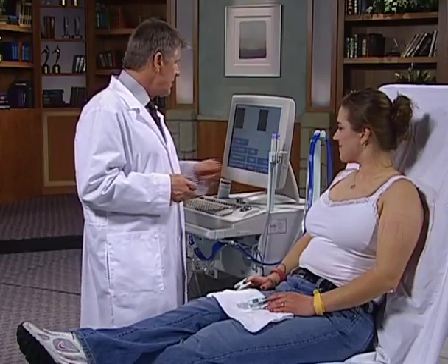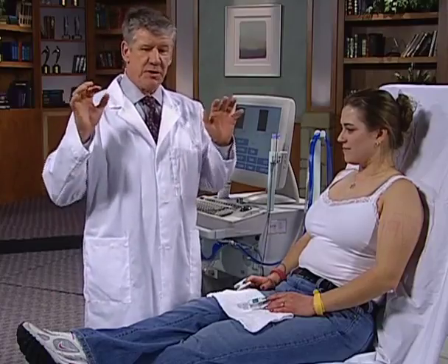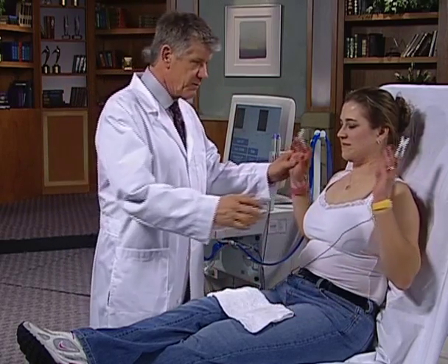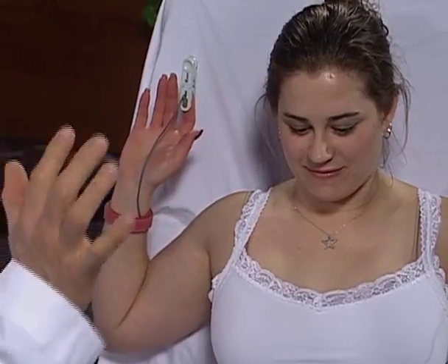We'll move on to our next site, which is going to be the costoclavicular move. This is with elbows back and hands up, palms out, sometimes called the stick-up position. So let's go ahead with that, Danielle. Sort of arms up, that's right. Elbows down. Okay, shoulders back.